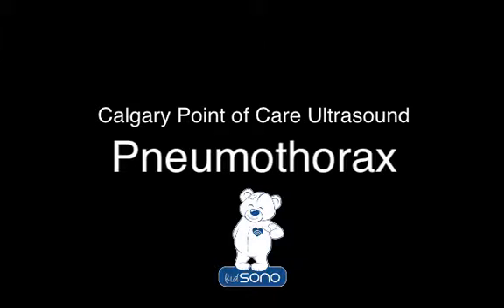You may be wondering, why ultrasound? I got a guy, he can take a picture for me. Sure, it may take a while, and he may grumble about the order not being in, but it seems to work out okay. Well, let me give you 3 reasons.